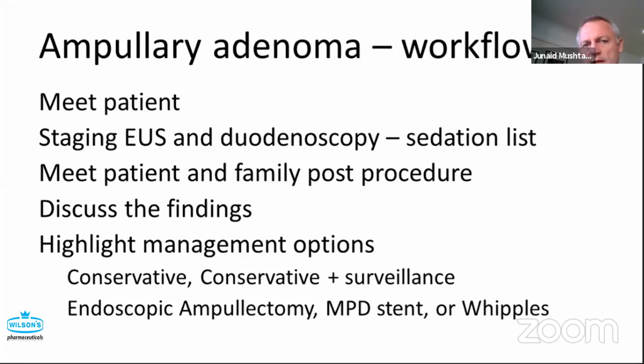So in the second case that I've told you about, what would I do in the workflow for an ampullary adenoma? So I will actually meet the patient. I will do that staging endoscopic ultrasound and duodenoscopy. I will do it on a sedation list, and I'm just going to look. I'm not going to take any more biopsies, but I'm going to look at it myself, work out what is required and whether I can do it.